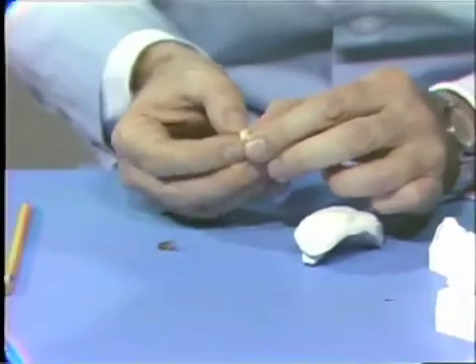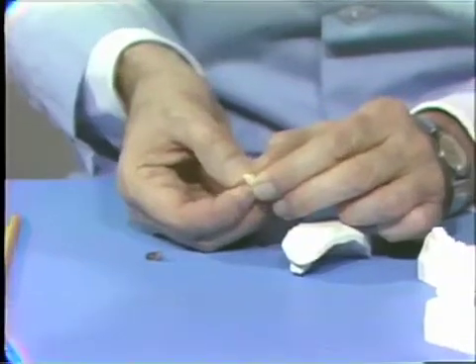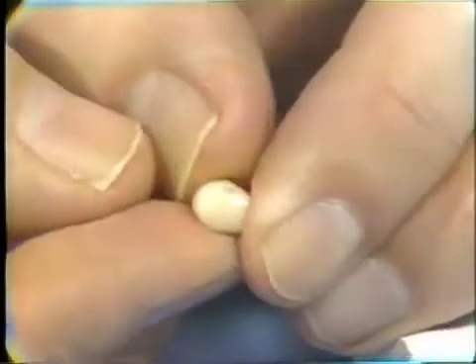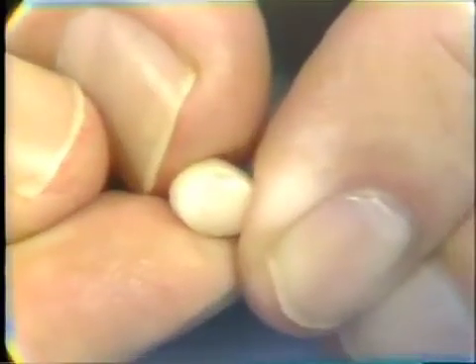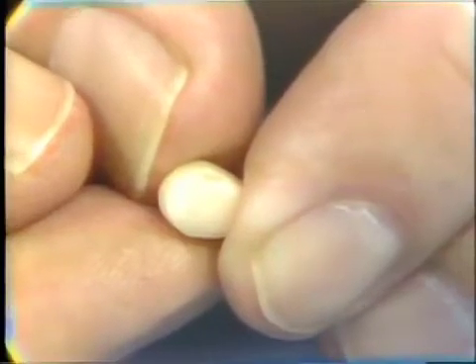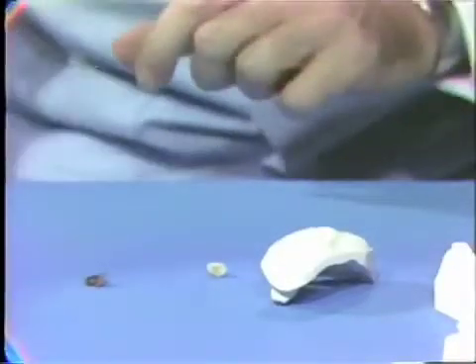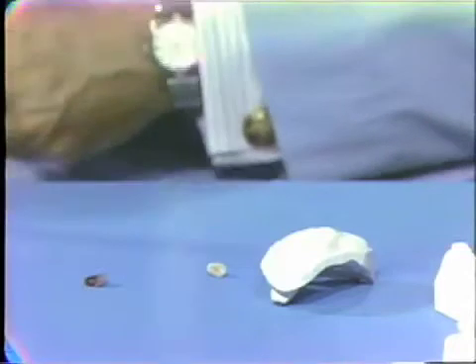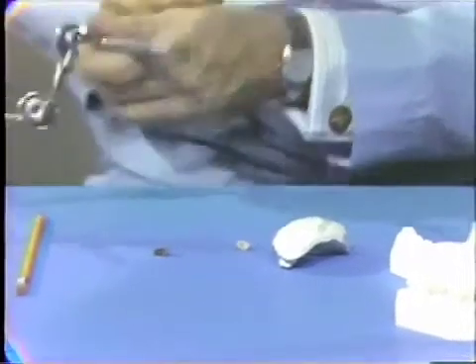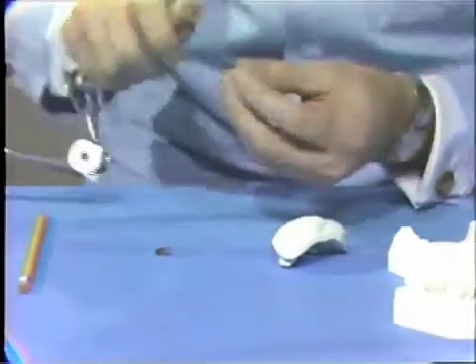And if you then look on the underside of the pontic facing, I think you can just see the marking of the pencil there where it has hit on the ridge on one side. So our next step now is to grind that area and then pop it back again on here and see what necessary adjustments are required. Now in doing this grinding, the Dedico grinding wheel is about the best point for grinding and cutting porcelain.